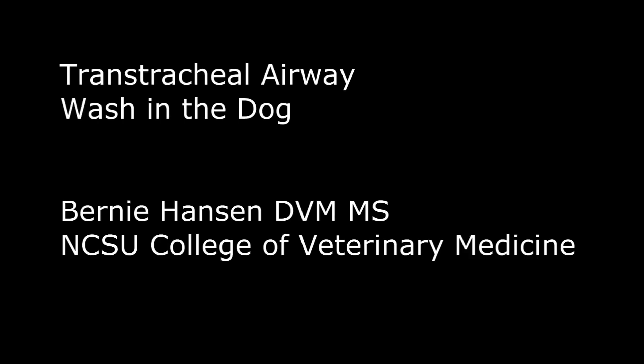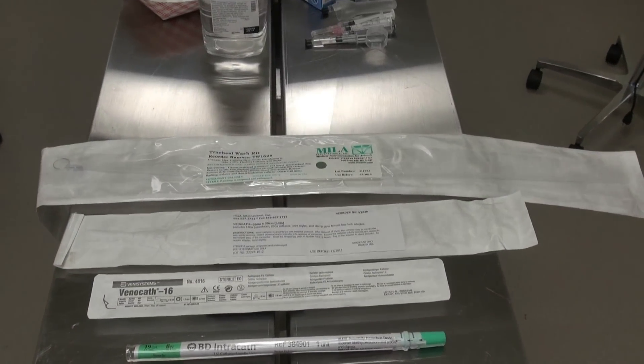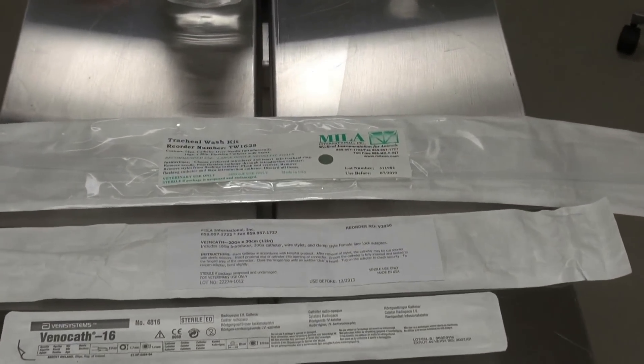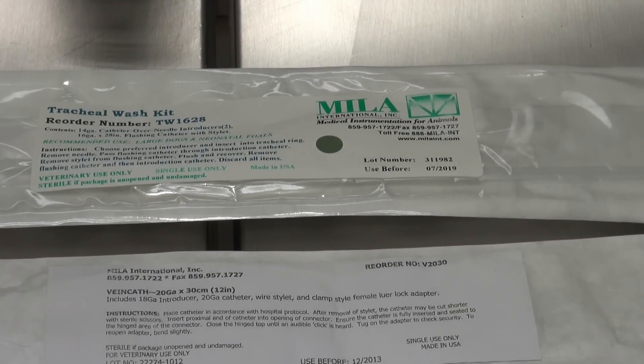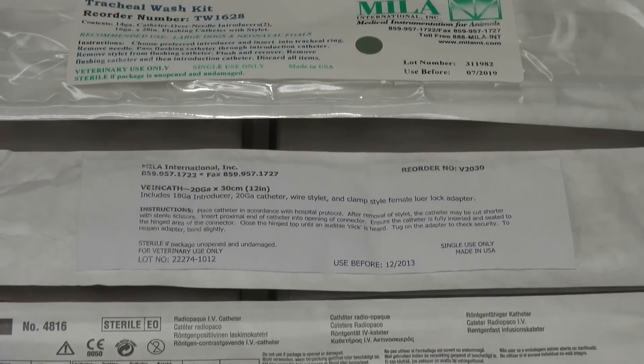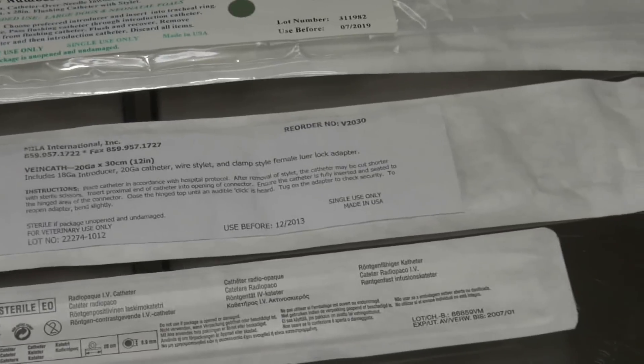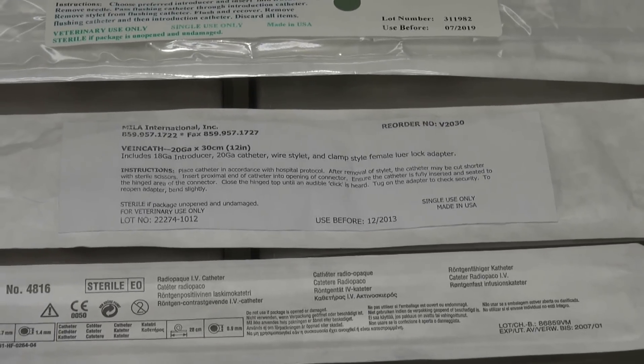This video will present the proper technique for transtracheal airway wash in the dog for VMC 937. There are several different catheter options used clinically to perform this procedure. Probably the most commonly used ones these days are long nylon transtracheal wash kits, but we'll also use a variety of through-the-needle style or intermediate style intravenous catheters.